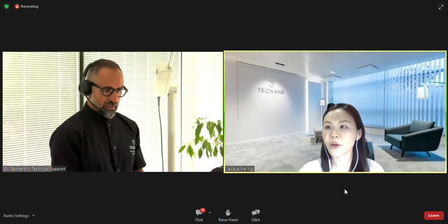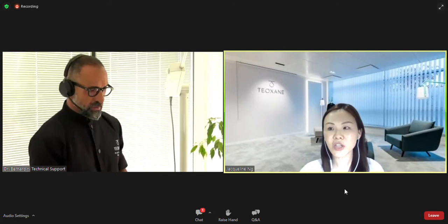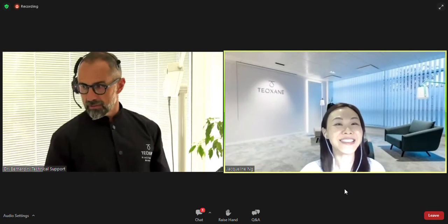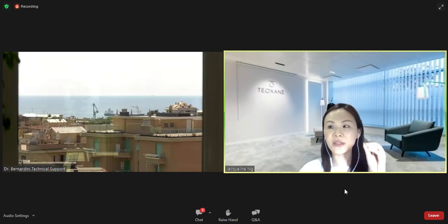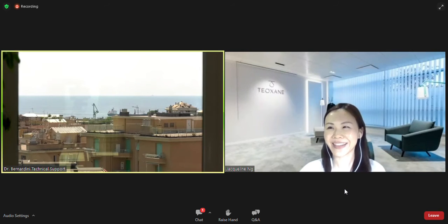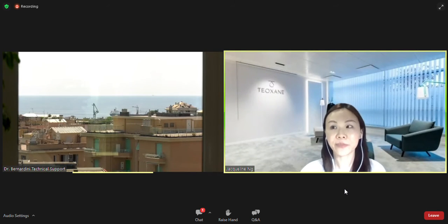Right. So a few questions around this. Dr. Bernardini has clarified his injection at the G point is definitely done deep. Maybe from the way that you're watching, it wasn't very clear, but so that we are all aligned, it is a deep injection. Okay, yes, thank you, Dr. Bernardini, for that clarification.